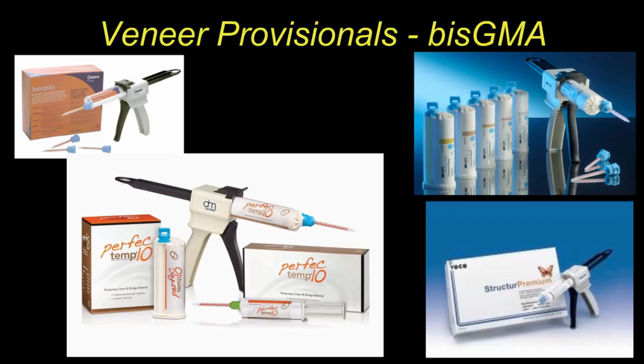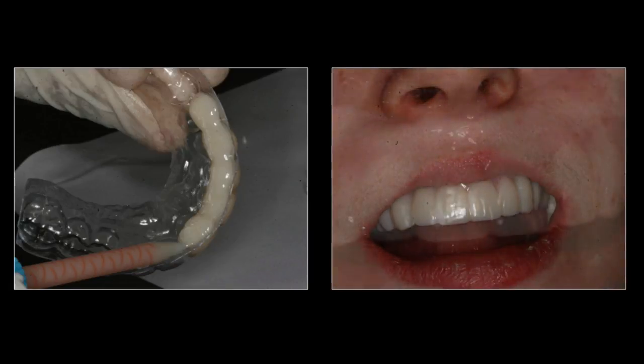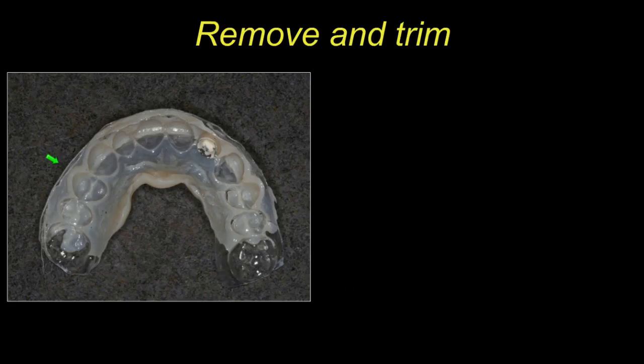For veneer provisionals, from a cost and time perspective, I prefer to make them chairside rather than having the lab do it — it's just a lot more expensive that way, and I can make short to medium-term provisionals that look really good at conversation distance. I'll place the material into the stent, seat it in the mouth, wipe off any excess on top, and leave it for the initial set time of a minute and 30 seconds. Then I tease it out, leaving it in place for the next two to three minutes to fully set.